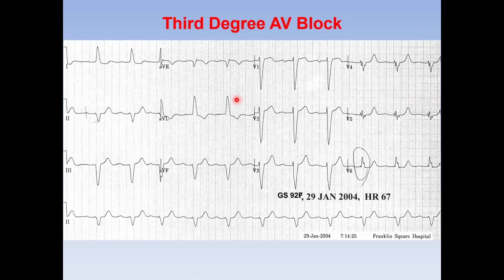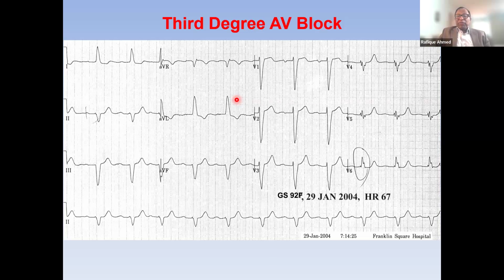When we talk about cardiomegaly, of course, it will have to be by echo, and we are looking at the left ventricle. But how do the guidelines say, sir? Guidelines, I think, are very liberal to put in the pacemaker irrespective of age, if the rate is more than 50. I mean, 50 for a young person is pretty big.